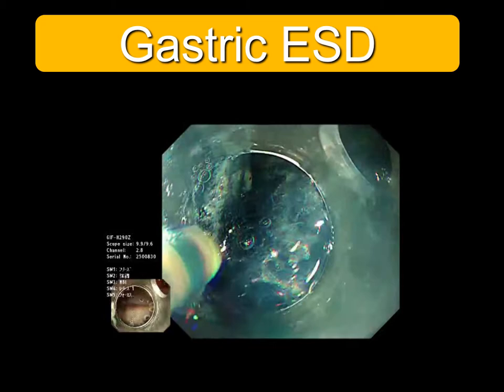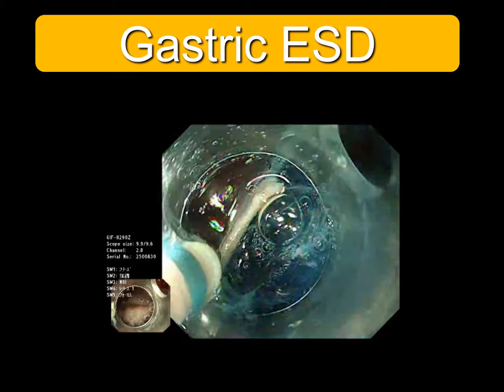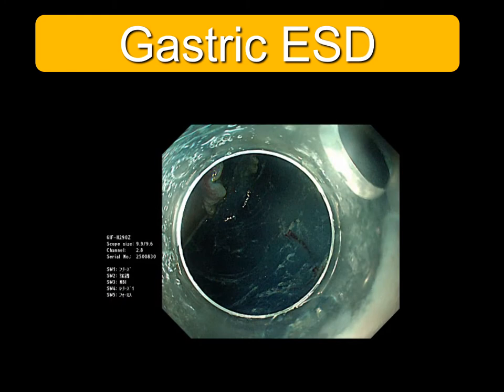The procedure is just dissecting the blue submucosal layer. It is very simple, isn't it? It is completed within 5 minutes in simple cases as you see.